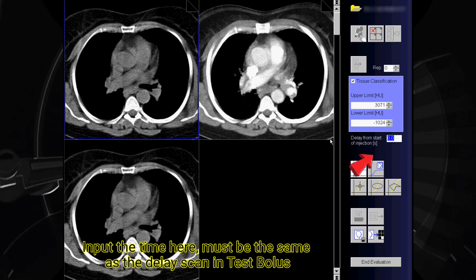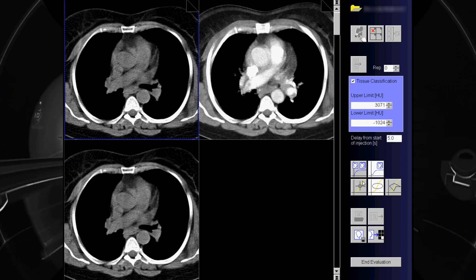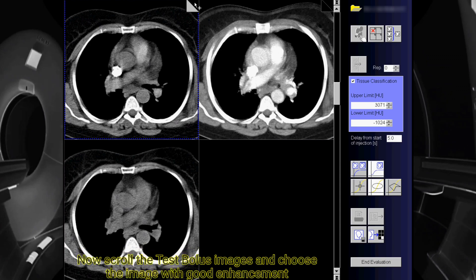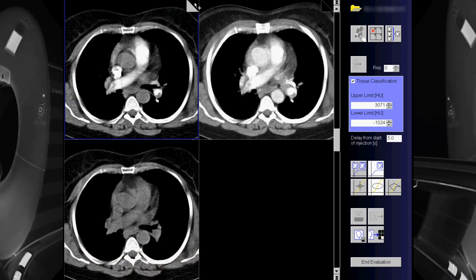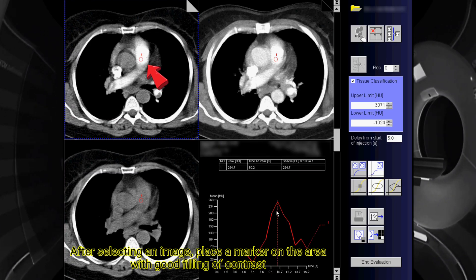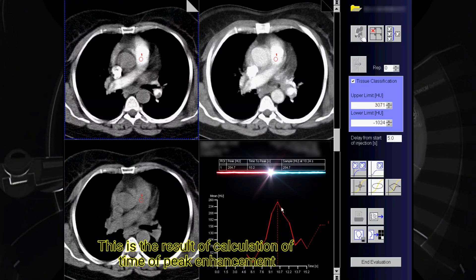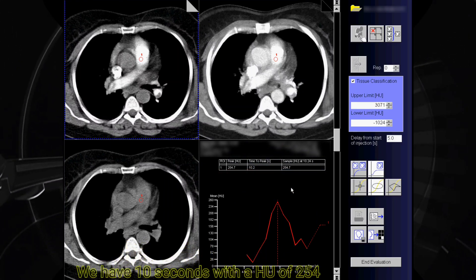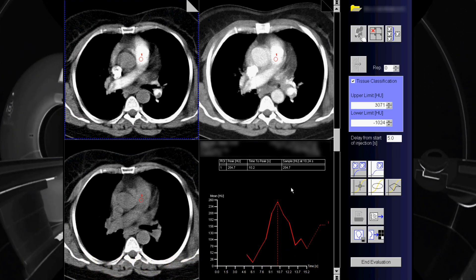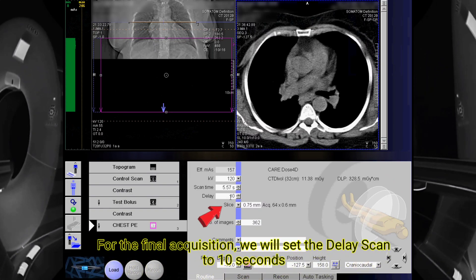Input the time here — it must match the same as the delay scan for the test bolus. Now scroll the test bolus images and choose the image with good enhancement. After selecting an image, place a marker on the area with good filling of contrast. This is the result of the calculation of time at peak enhancement: we have 10 seconds with a Hounsfield unit of 254. For the final acquisition, we will set the delay scan to 10 seconds.